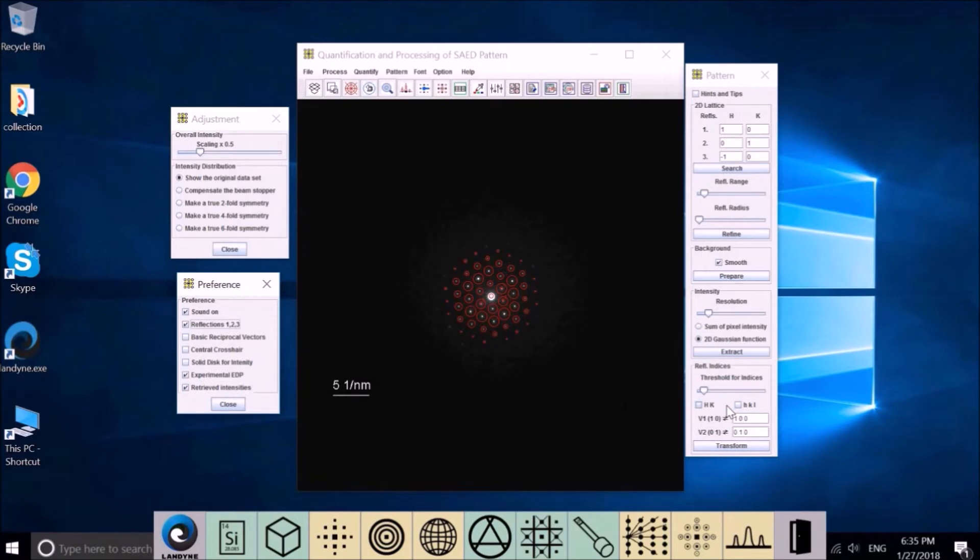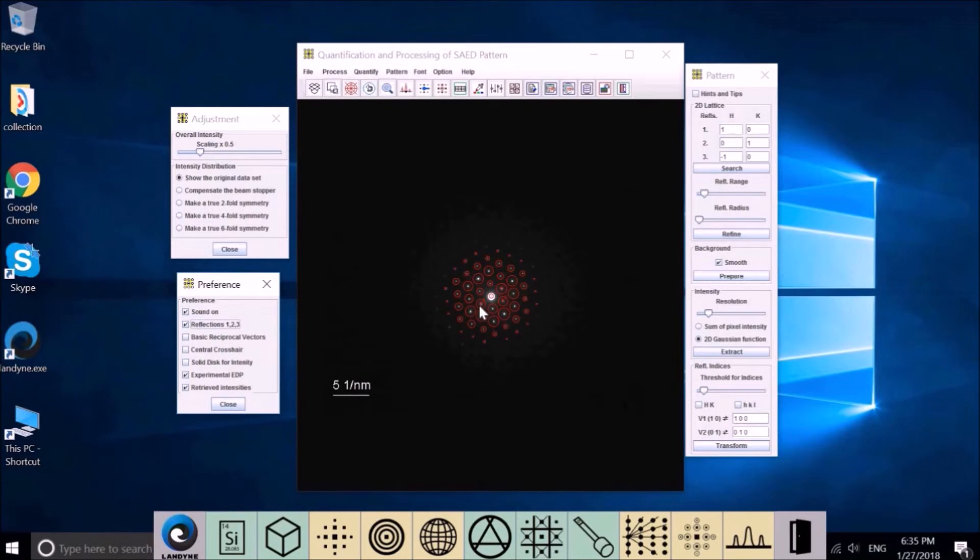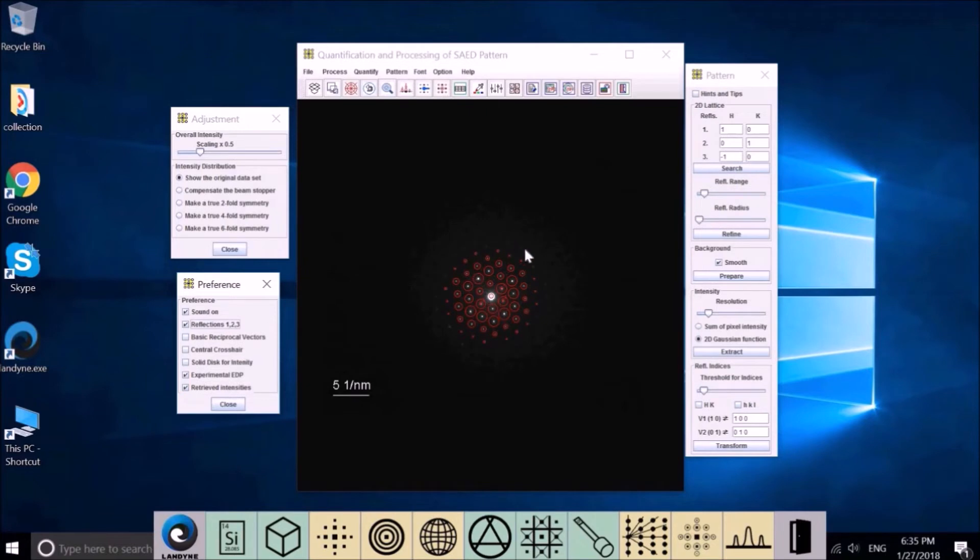We'll show the rest of it later. Let's go to Preference. Here we can choose the sound on or off during the process. We can show the three chosen reflections, one, two, three, on or off.